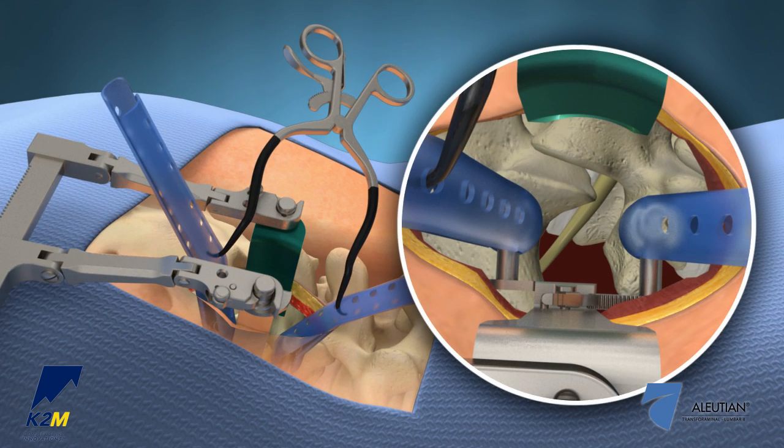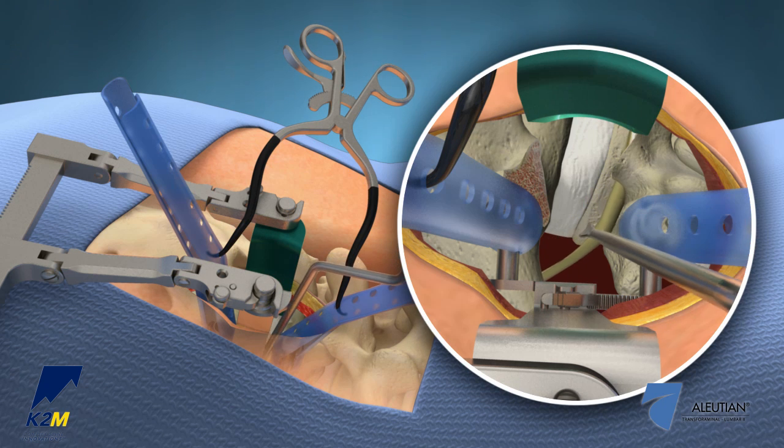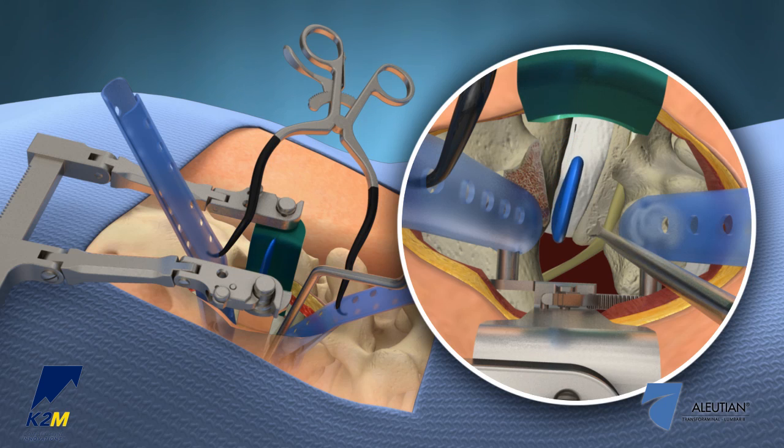Using a combination of surgical instruments, perform a facetectomy by boxing out the pars laminar junction. A bayoneted nerve root retractor can be used to mobilize the nerve root and expose the annulus of the disc space. Using a scalpel, a portion of the annulus is removed and a complete discectomy is performed.